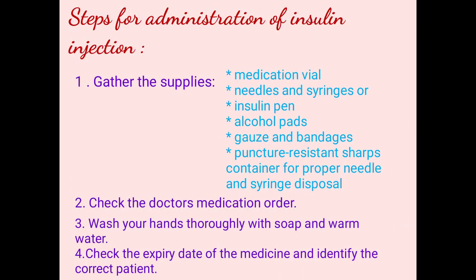Now let's see what are the steps for administration of insulin injection. Gather the supplies, check the doctor's medication order, wash your hands thoroughly with soap and warm water, check the expiry date of the medicine and identify the correct patient. At least check the medicine 3 times.